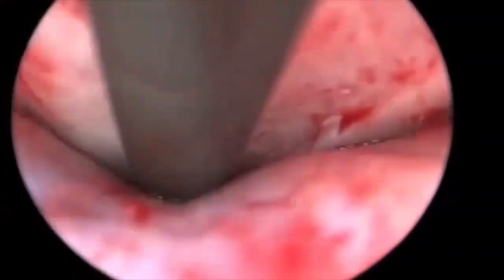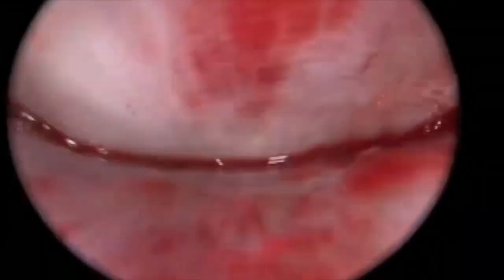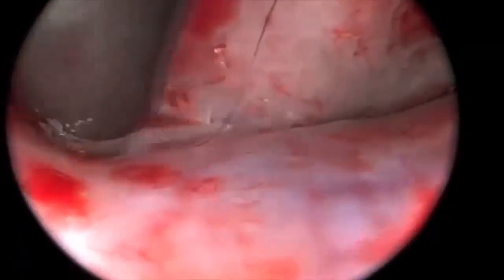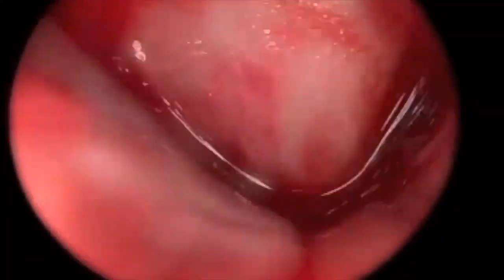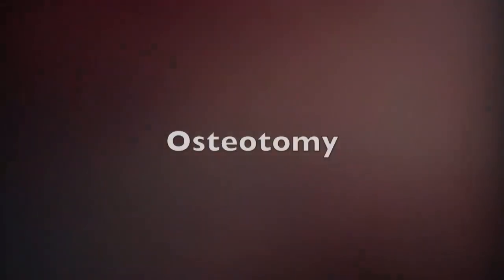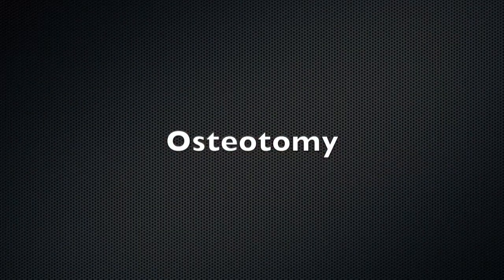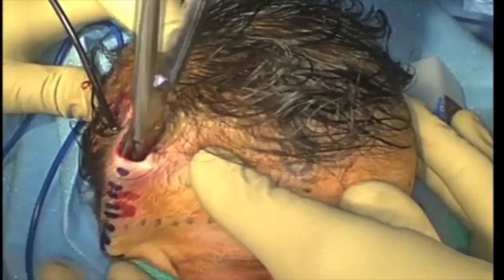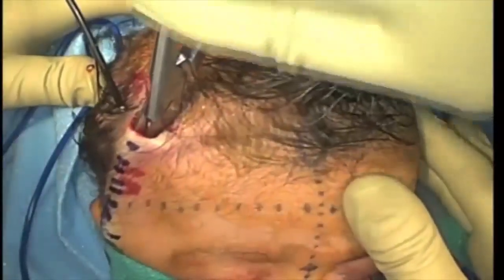Next, attention is placed towards the pterion by advancing the endoscope and suction in tandem towards the greater wing of the sphenoid and the orbital roof on the affected side. Here one can see the greater wing of the sphenoid. The endoscope is directed posteriorly and inferiorly to reach the squamosal suture, which is the key anatomical landmark for full separation of the bones. Here it is. The osteotomy can then be performed once again using bone cutting scissors, Mayo scissors, or bone cutting scissors.